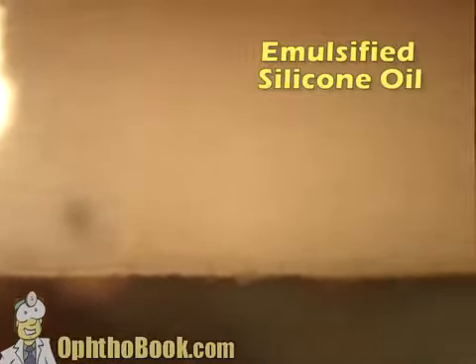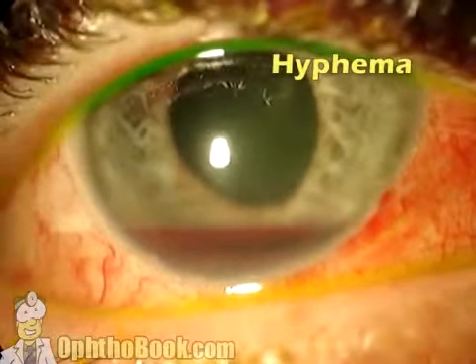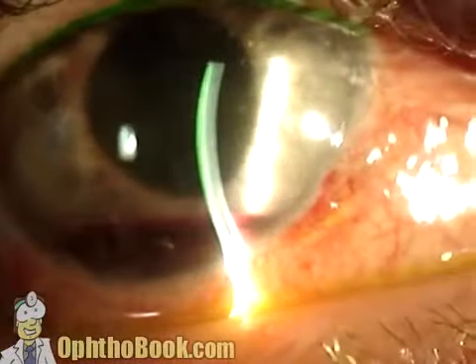This is emulsified silicone oil. After a retinal detachment surgery, that silicone burped into the front part of the eye, and silicone's lighter than water. It floated to the top and created almost an inverse hypopyon. Blood is heavier than water, and so this is our hyphema, and it's sunken to the bottom of the anterior chamber, and it's very easy to see here.